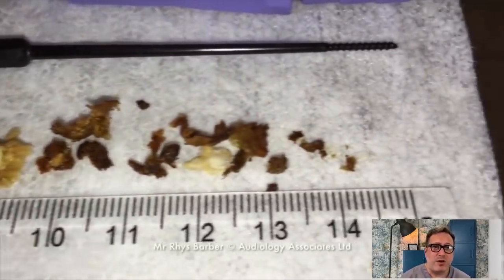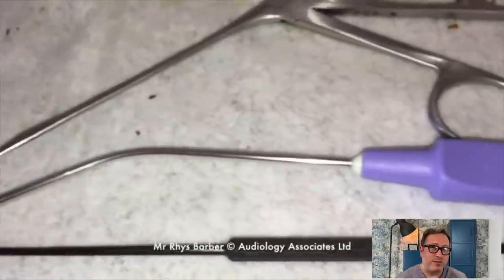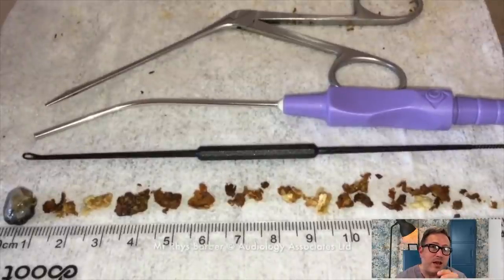Look at all these pieces. Now bearing in mind, the first piece you see there to the left — that's what came out of the first ear. These are the tools we used as well. Everything else came out of that first ear. The block on the left hand side up to about a centimeter was from the second ear; everything else came out of that first ear.